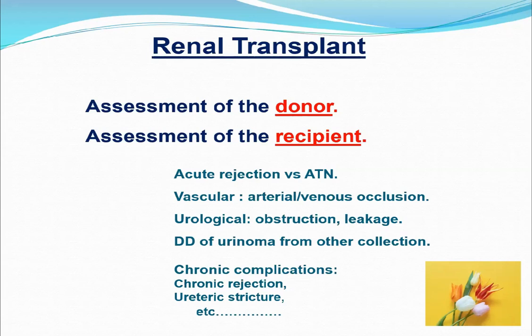Then detection of complications of the renal graft after transplantation, either parenchymal medical complications such as ATN in the first month, and rejection, cyclosporine or FK or any immunosuppressive toxicity, other surgical complications such as obstruction, vascular complications, leakage. Any of these can be done by radionuclides.